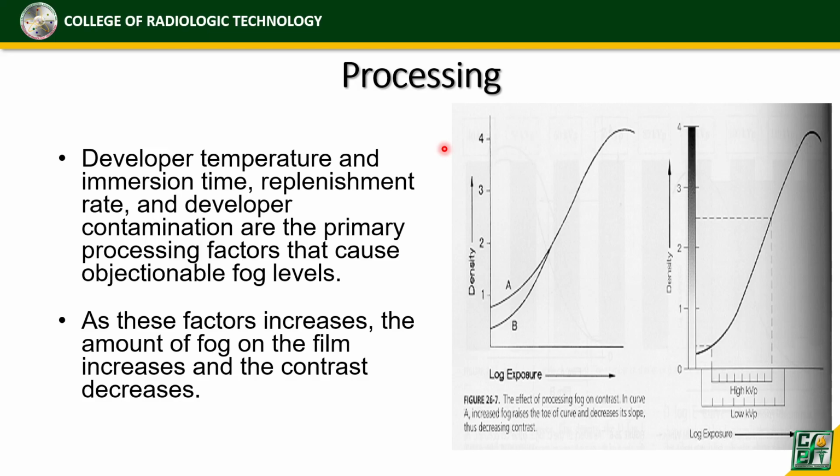So, isa pa example, sabi dito binanggit, developer contamination. What do we mean by developer contamination? Halimbawa yung developer na contaminate siya ng fixer. So, ano nangyari? Nahaluan ng fixer yung developer. Okay. Nang develop ka, sa palagay mo ano mangyayari? What do you think will happen to your radiograph?